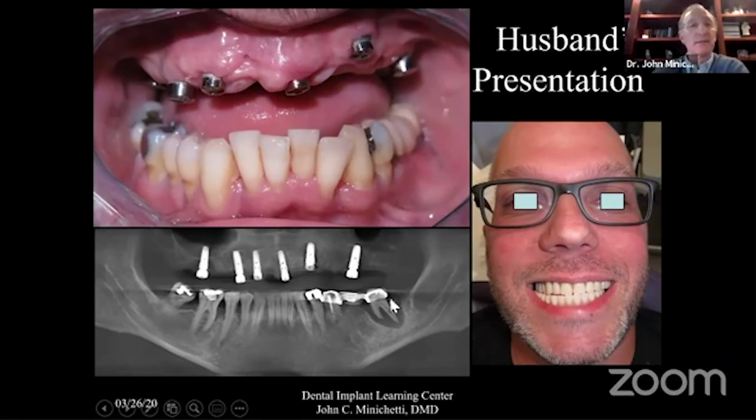The treatment plan, according to the other doctor, was going to be a screw-retained detachable type prosthesis for his upper. On examination of Anthony's mouth, we can make some diagnoses for the husband. The diagnosis is a failing implant already in the area of number 3.